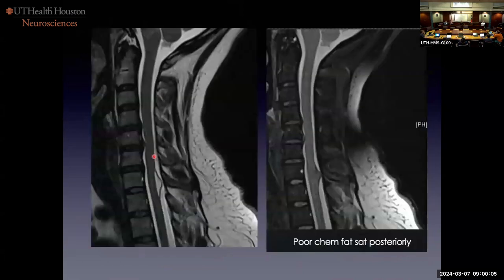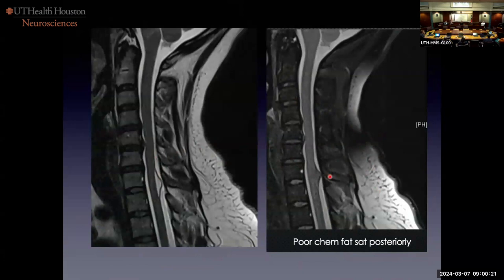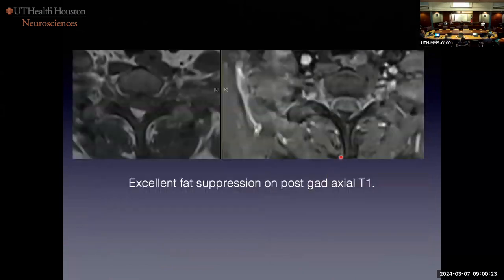We go beyond that and look at the axial T1s. Pre-contrast there's no fat sat, but post-contrast with fat sat, it got really really black — again, no other explanation. And then we have the chemical shift artifact. If this is the frequency encoding direction and this is fat, it's going to shift to the lower field location because the magnet is only tuned to water. Fat precesses at a lower frequency, so the magnet places it as if it's water, shifting to low field. You get a signal void and signal piling up.